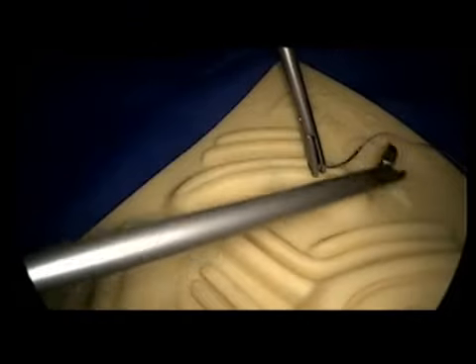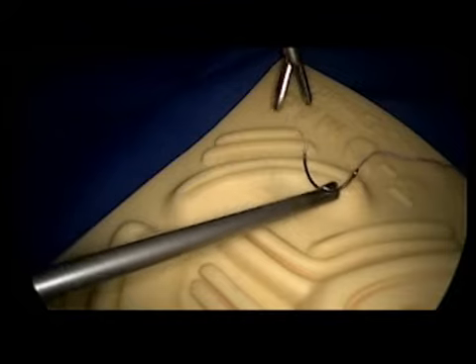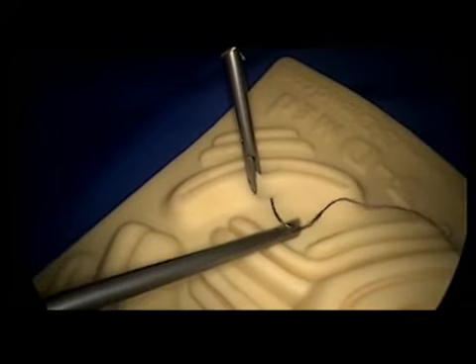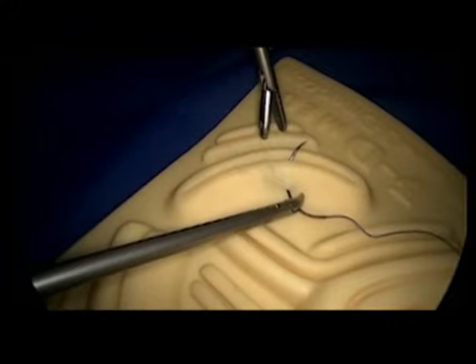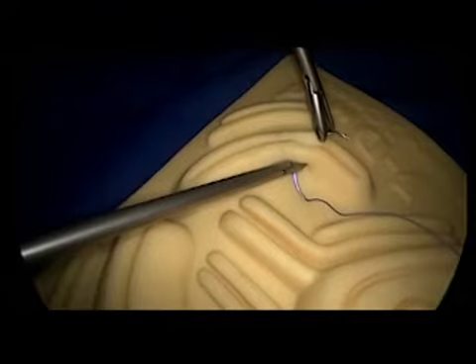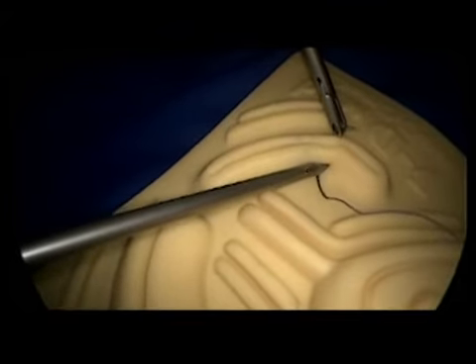If bridging of the tissue is to be performed, the tissue is placed into position and the needle is grasped and passed through one side of the defect. The other side of the defect is grasped and placed in a position that enables passage of the needle through the opposite side. The rotation of the needle is continued.